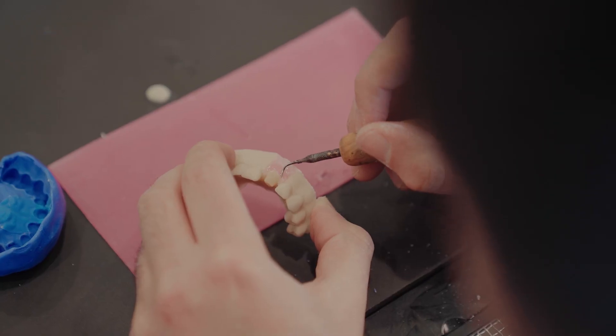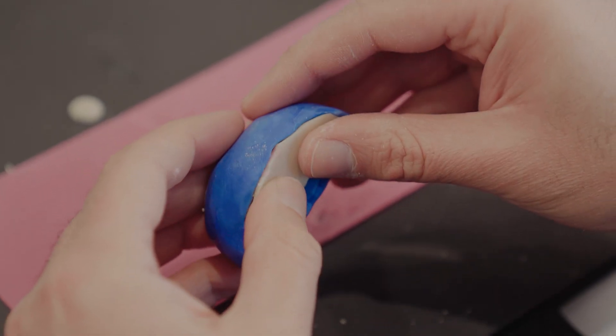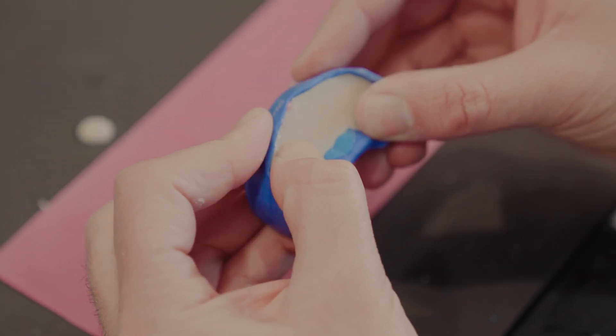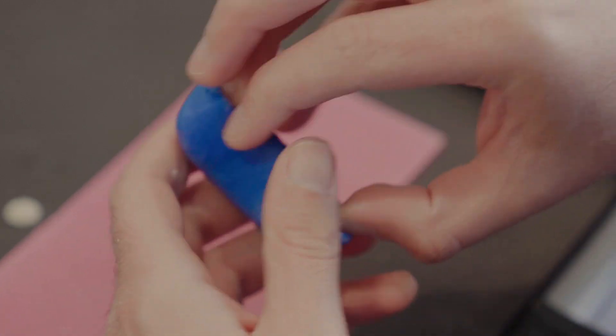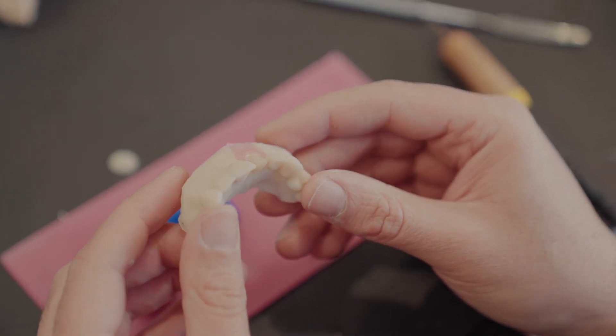We make the wax a little bit warm, then put it back in the silicone index so that it takes the form. This gives us a very fast, quick method to replicate the gum color. We wait until it's set, then remove it — and our model is ready. This is an easy, fast way to replicate an aesthetic model.